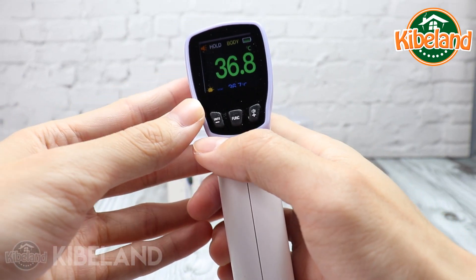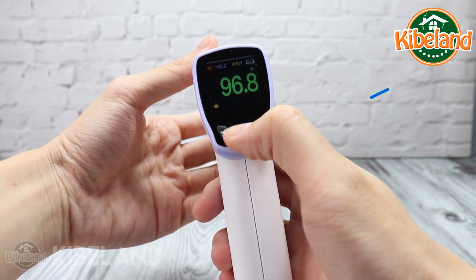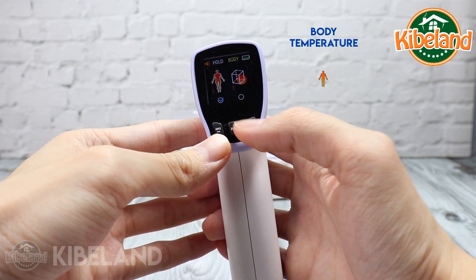Red font indicates high fever at 40 degrees Celsius and above. To switch the unit to degrees Fahrenheit or degrees Celsius, press the unit key. Press the funk key to enter the measurement mode selection — you can select body or surface temperature.